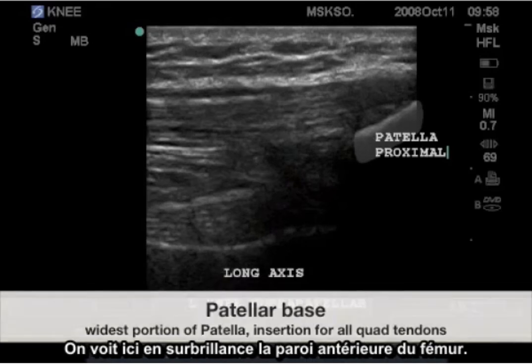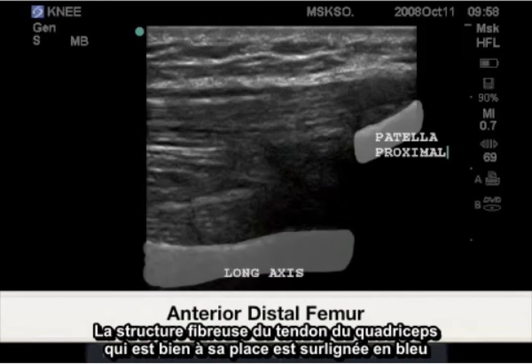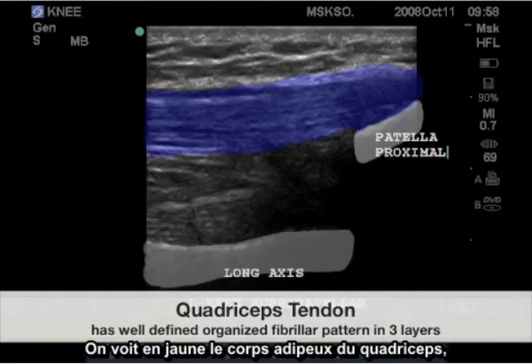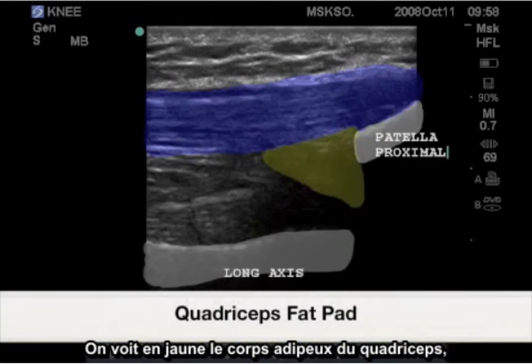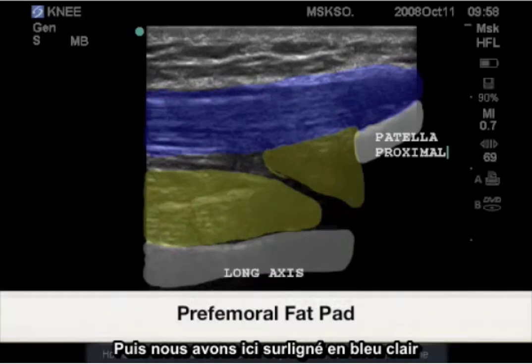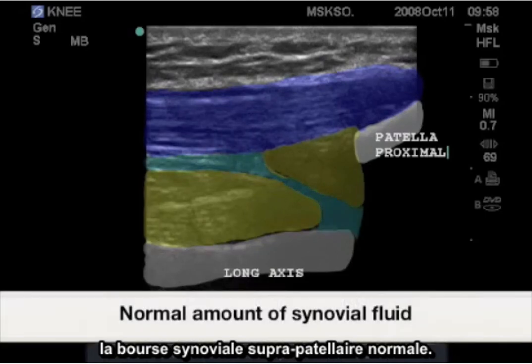Highlighted here is the anterior margin of the femur. Highlighted here in blue is the fibrillar pattern of the normally situated quadriceps tendon. Highlighted here in yellow is the quadriceps fat pad, and also highlighted in yellow is the perifemoral fat pad. Next, highlighted here in light blue is the normally appearing synovial recess of the suprapatellar bursa.